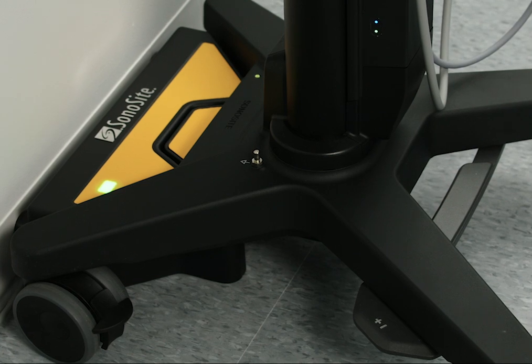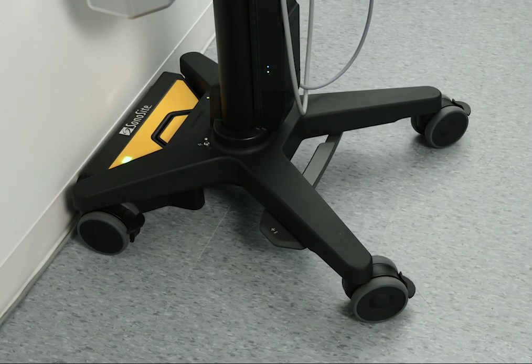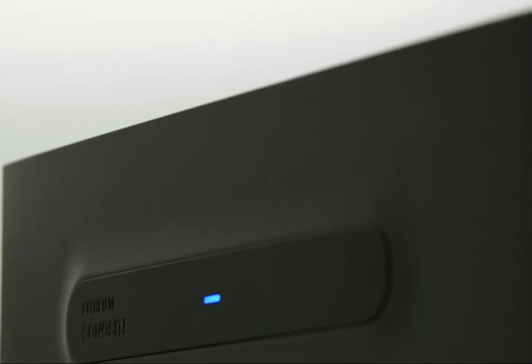The light on the PowerPark module should turn on. To prevent the system from disengaging, lock one or more of the wheels. To make sure that your system is charging, check the light in the upper left corner of the touch panel or on the back of the clinical monitor.